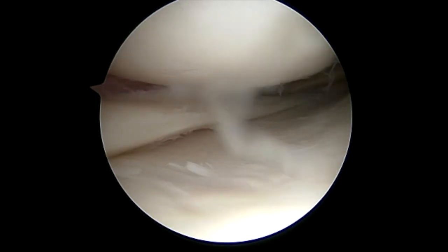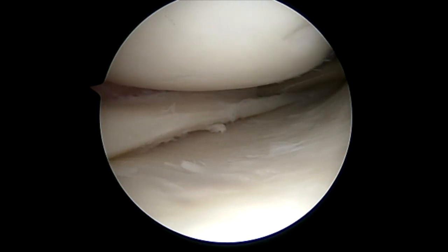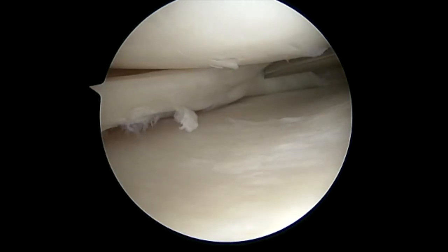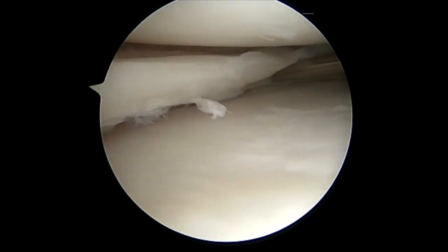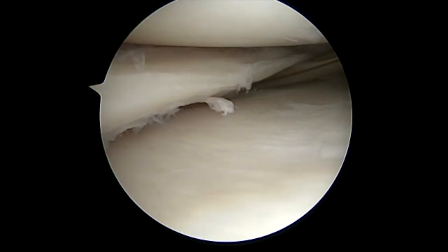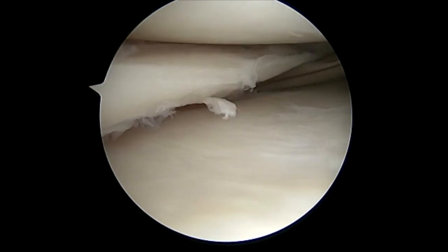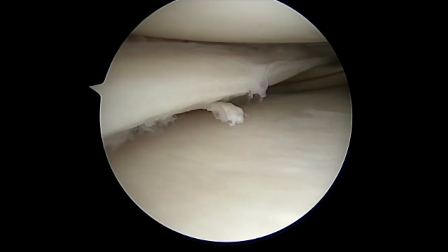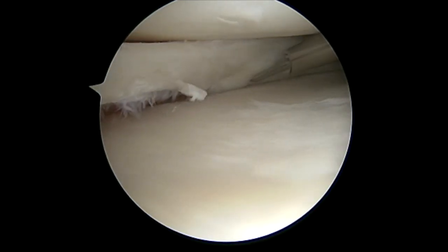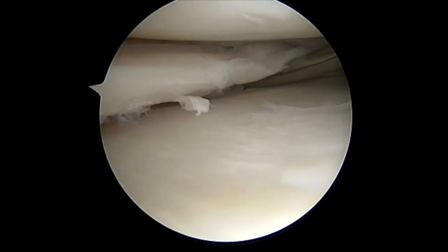We now use an Arthrex zone-specific self-guided cannula system and will place roughly eight to ten stitches composed of suture tape into the meniscus. This is a newer technique, and the suture tape has higher tensile strength than previous sutures we've used. The nice thing about this device is it can be done by a single individual — as you can see, I'm actually holding the leg and passing the stitches throughout with ease.